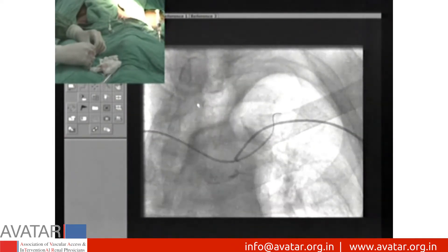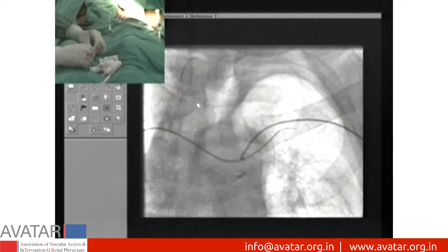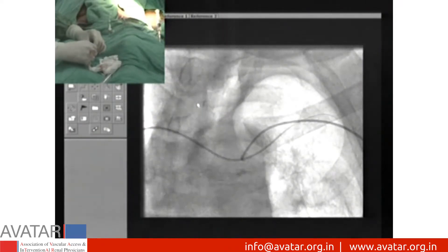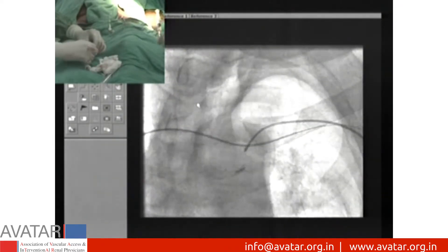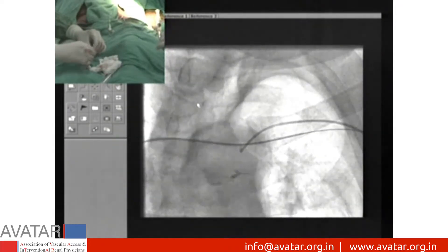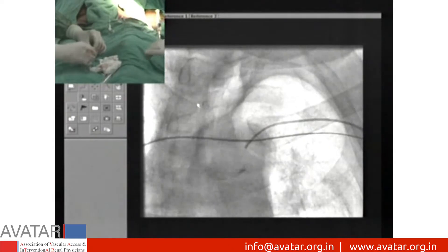Finally, we succeeded in crossing the stenotic lesion, and with the help of a snare, the wire is taken out through the fistula side puncture.